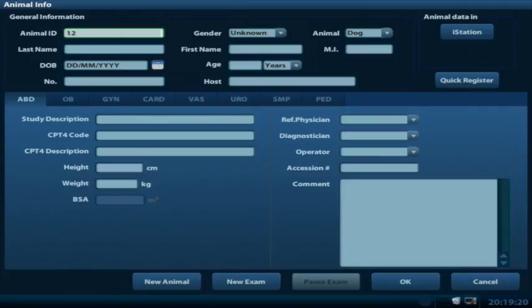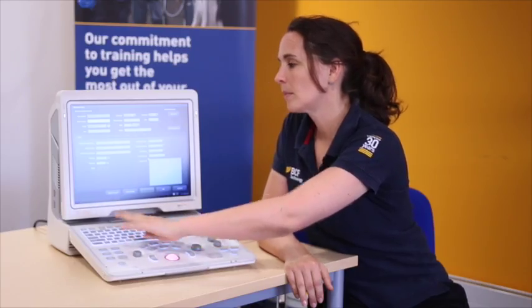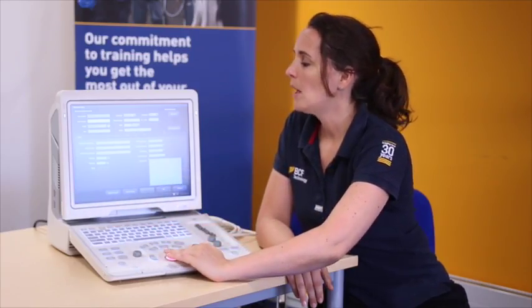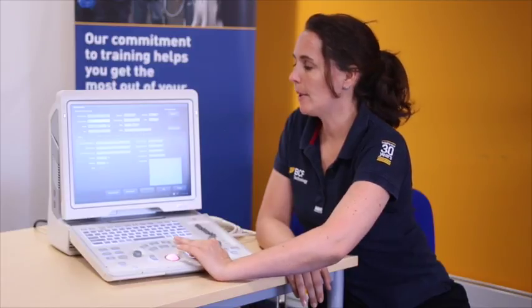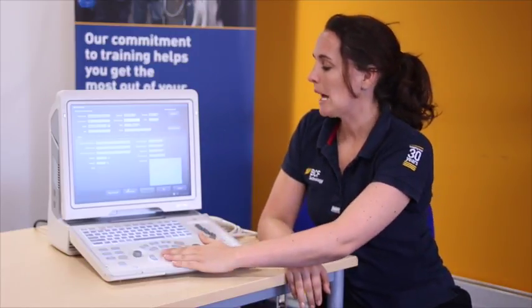Then as a minimum database entry, I'd add in the last name of your patient. There are other values you can input, and that is completely up to you. Once you're happy, you just hit OK, and that will take you back to your initial scanning screen.